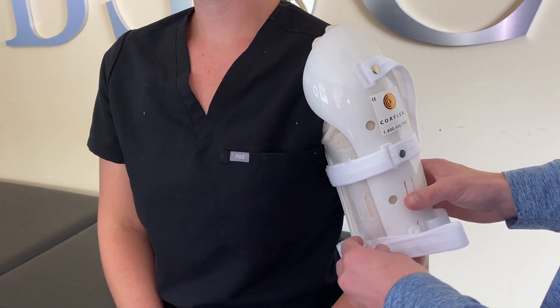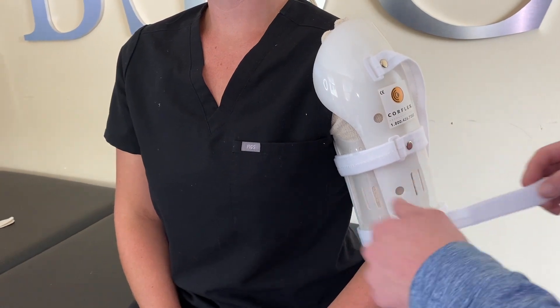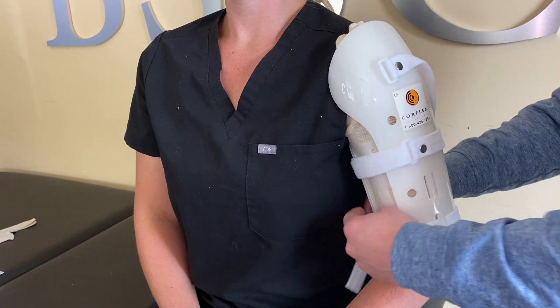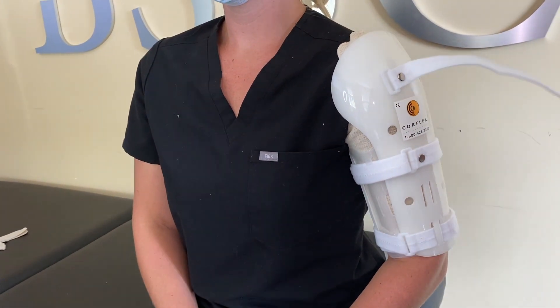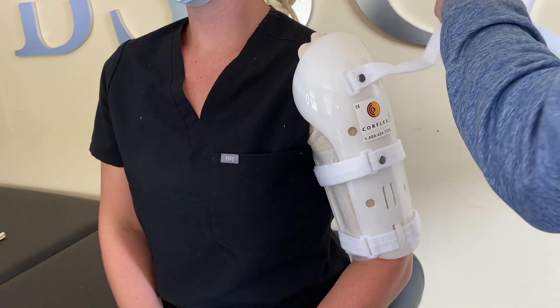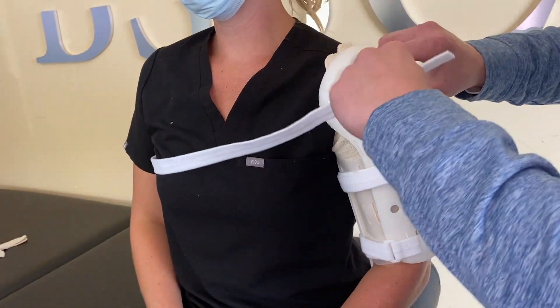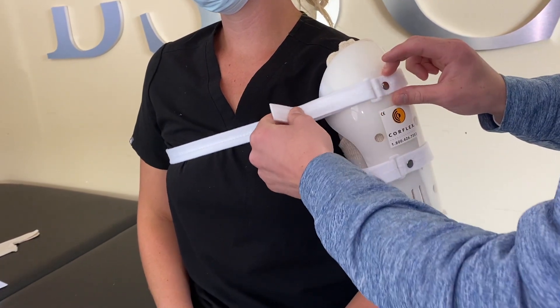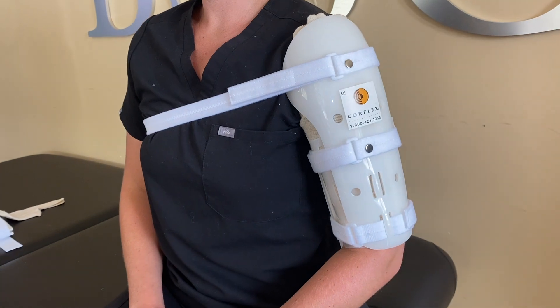Next, gently tighten each strap and velcro to secure the inside and outside portions of the splint. The splint should be tight enough to ensure that it does not move, slide, or migrate down the arm, but loose enough so it does not compress blood circulation or cause further bruising. Then grab the longest strap and place it across your chest, underneath the opposite arm, wrapping around your back. Lastly, fasten the strap through the buckle and velcro to secure the splint in place.